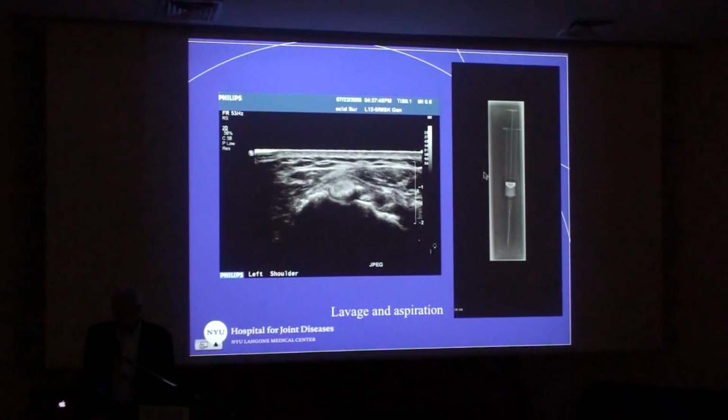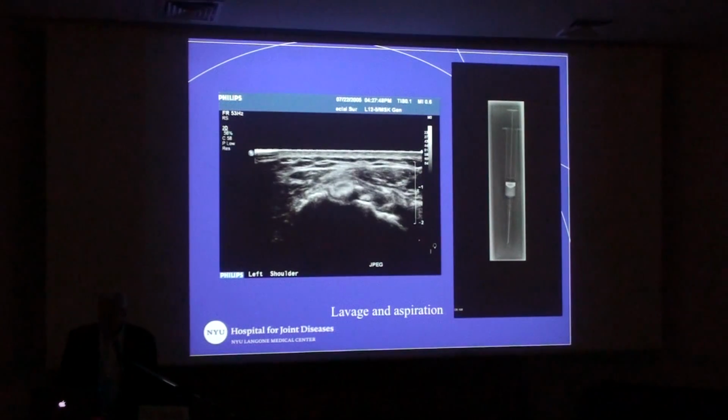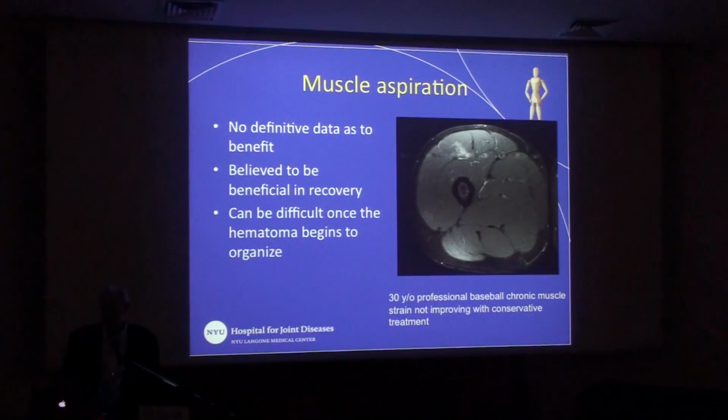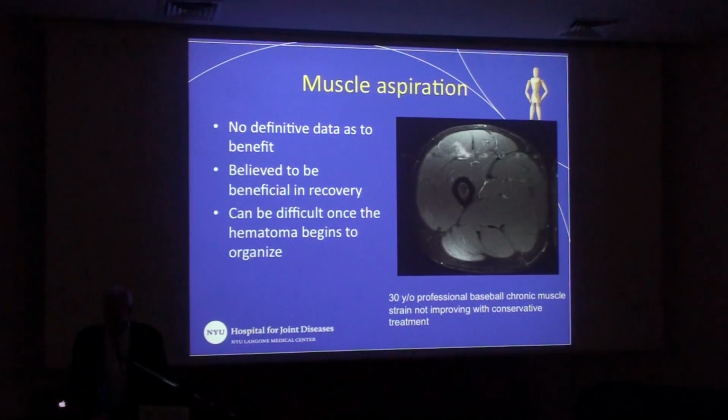So this is what this material would look like on an X-ray. Just to give you an example, we may go anywhere from 8 to 10 syringes of this, depending on how large the calcification is. So it could be fairly significant, but these patients do remarkably well. In my own experience, we followed 40 or 50 of these patients out 3-4 years, and 75 to 80% of them had good to excellent results, based on clinical outcome measures. So these patients can do quite well, and very few of them have to come back for reaspiration.